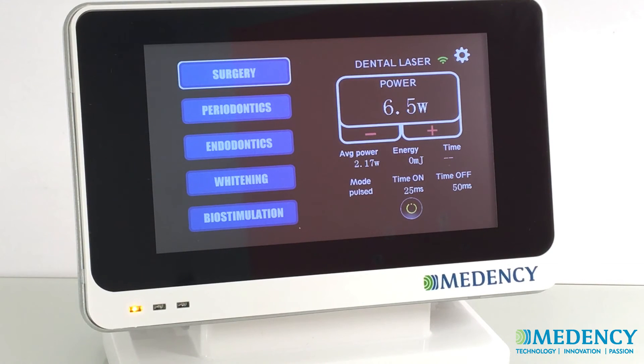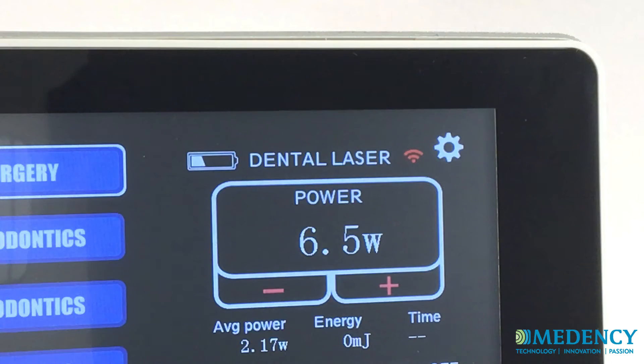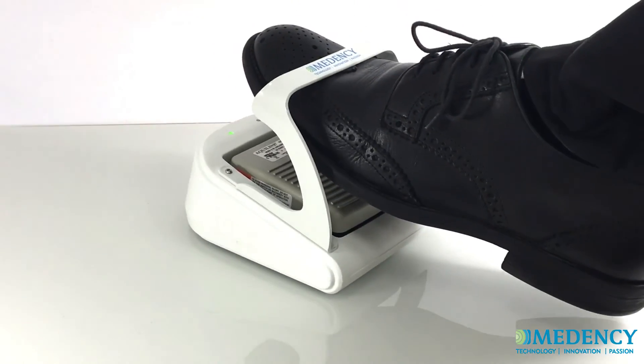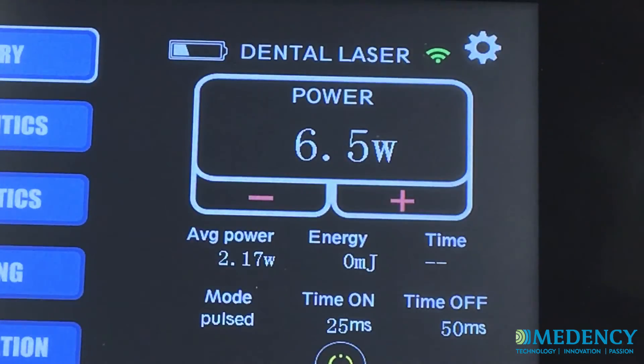Before starting, become familiar with several important elements. The wireless signal strength indicator in the upper right corner of the screen indicates the wireless signal between the laser and its foot switch. To verify that the laser and foot switch are paired, the wireless signal indicator should be green. The laser and foot switch are paired at the factory. Beside it is located the setting icon to access the settings screen. Finally, the battery strength indicator shows the remaining battery life for the laser system.